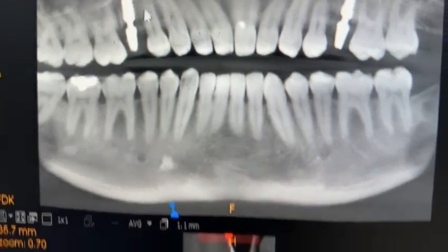We will see the cross section here. You can see it is getting engagement from the junction between the sinus and the nasal floor. This is a fresh extraction socket. Probably this is a Bioline 4.2 by 16.